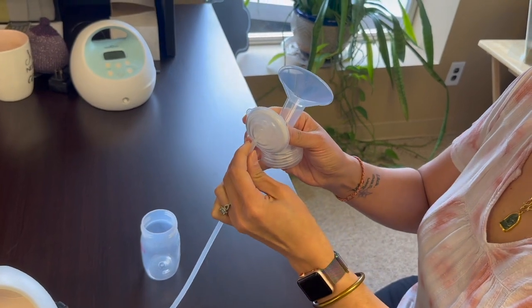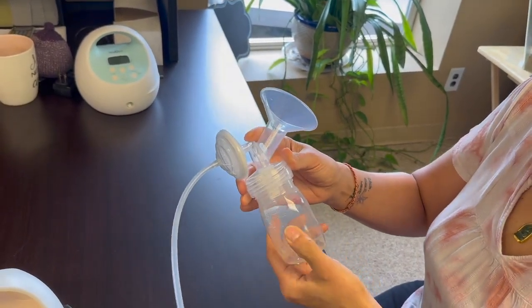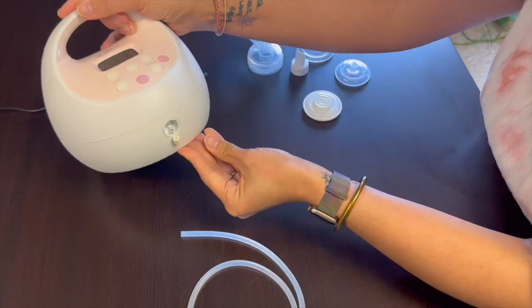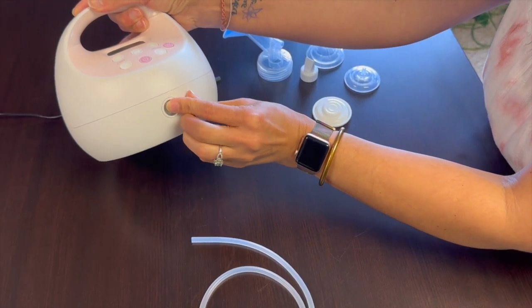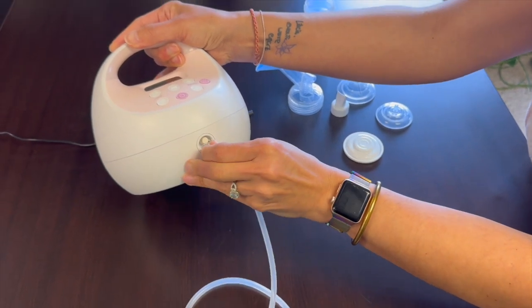Once all your parts are together you can attach the tubing. The tubing goes into the back of the backflow protector and then plugs into the pump. You have the option of pumping on one breast or both. If you choose to pump on one breast you will need to cover the vacuum nozzle with the air cap.